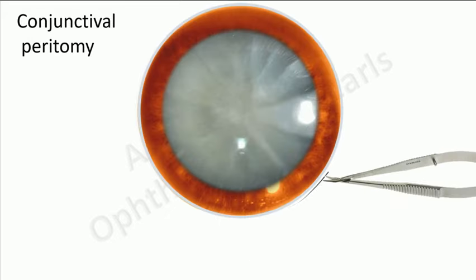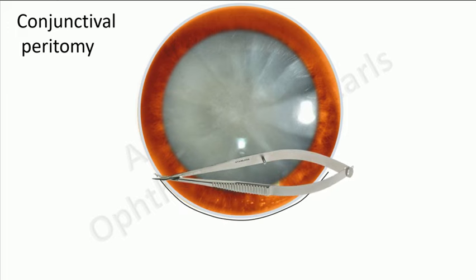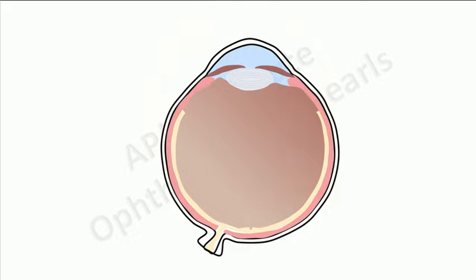Next is the opening of the conjunctiva, or conjunctival peritomy. Using a conjunctival scissors, a fornix-based flap is made, that is, a flap with an incision at the limbus and which is reflected towards the fornix. Bleeders are cauterized with a bipolar cautery.